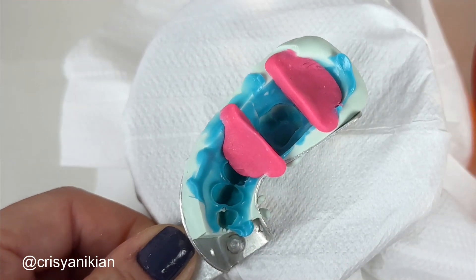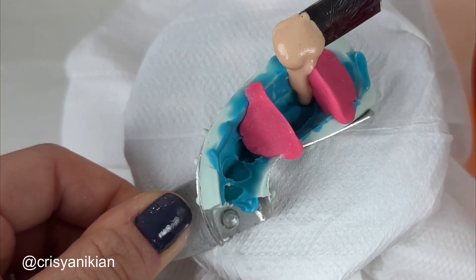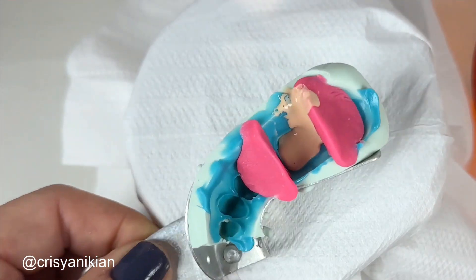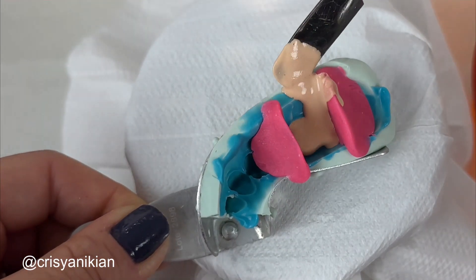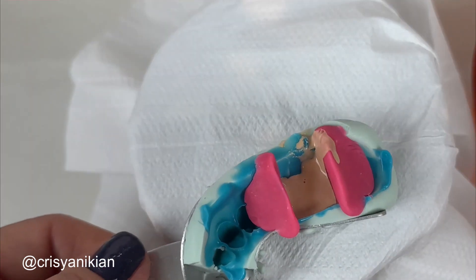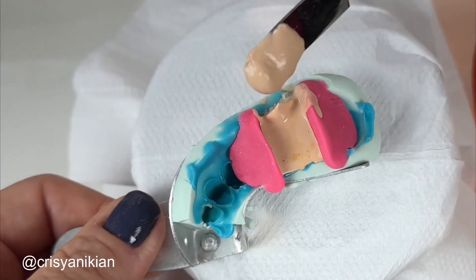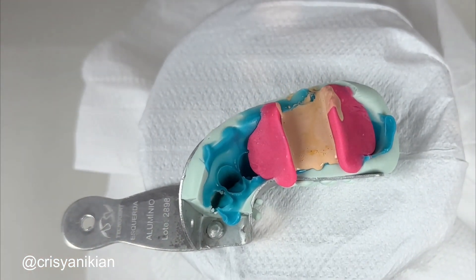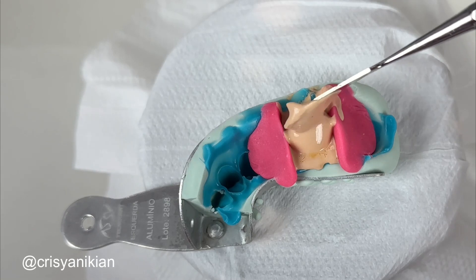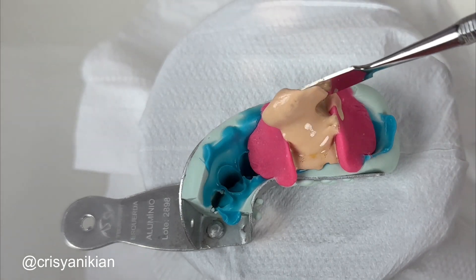Place the mold on the vibrator and pour the plaster little by little with a small spatula, such as a number 31 wax spatula. When completing the tooth region, you can pour a larger amount of plaster. Leave excess plaster on the ridge — the higher this plaster, the easier it will be to make the die.